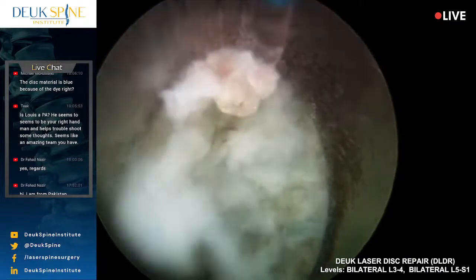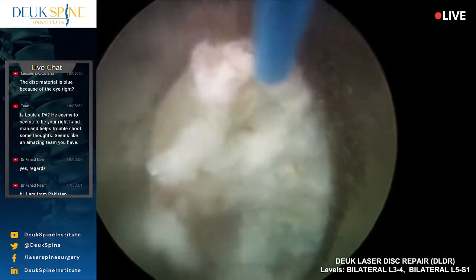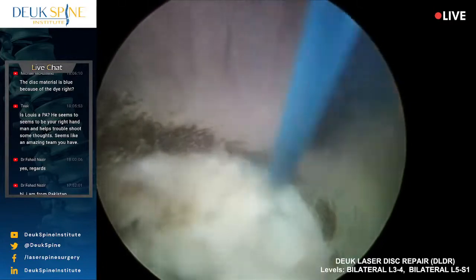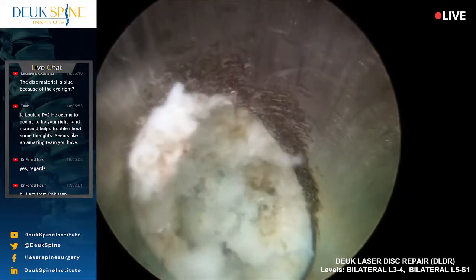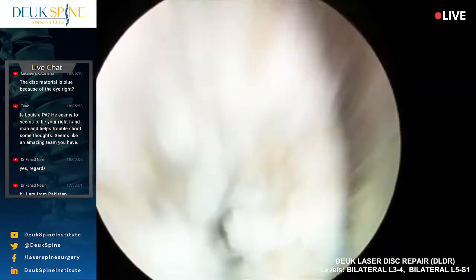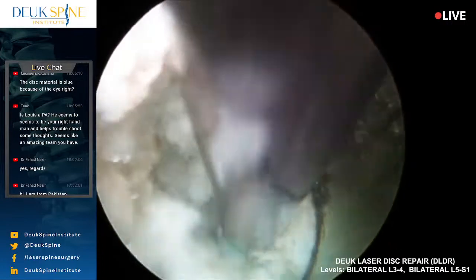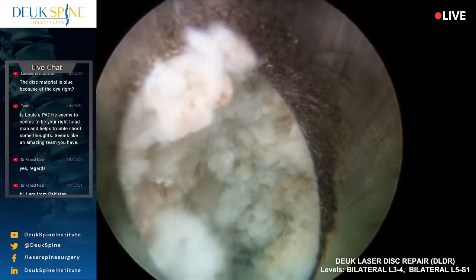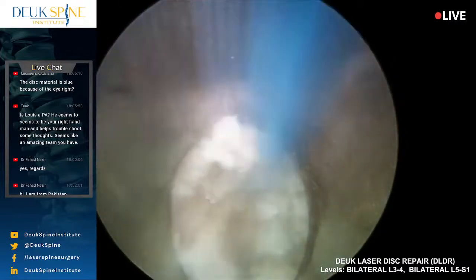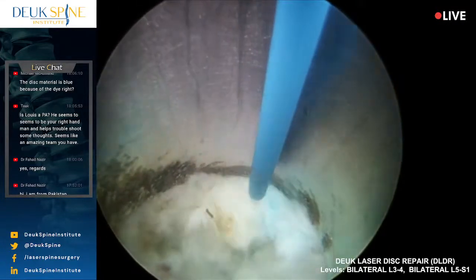Doc? Yep. I don't know if you want him that late. I'm okay. All right, that's fine. You're almost done. No, I'm almost done with this disc. I still have one more. This disc is a never-ending disc. Just lay still, you're doing good. I've never seen that, a hundred fragments of disc. Let me know when I can proceed. Stay still, you're doing okay.